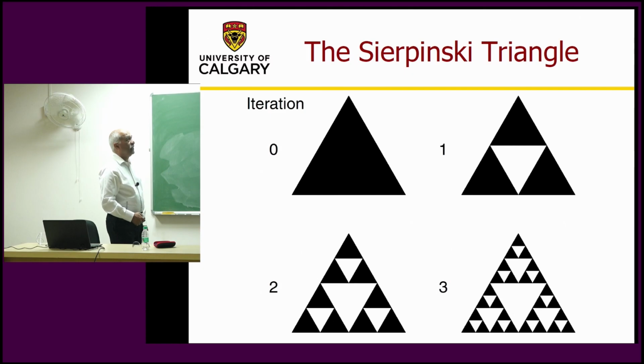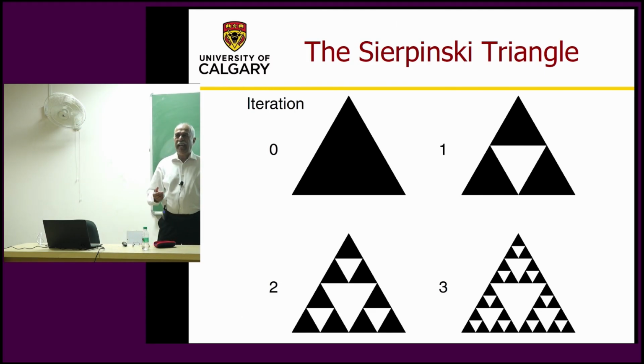There is another pattern called the Sierpinski triangle. There is some placement rule again. You keep breaking and you get more complex pattern. There is another measure of complexity called lacunarity. That becomes evident here. Fractal dimension is based on what is present. Pixels that are having a value, 1 or whatever.